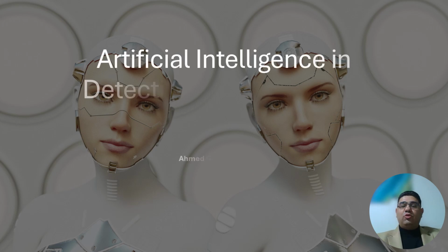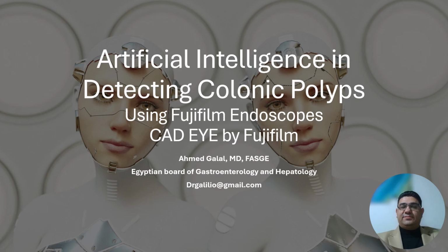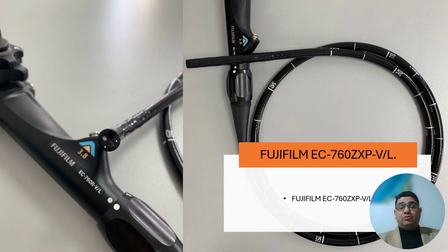Hi, today we will talk about artificial intelligence in detecting colonic polyps using the Fujifilm endoscope and the CAD EYE by Fujifilm. In this case, we use Fujifilm with the zooming function for better characterization and detection.